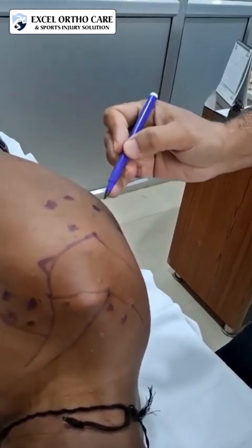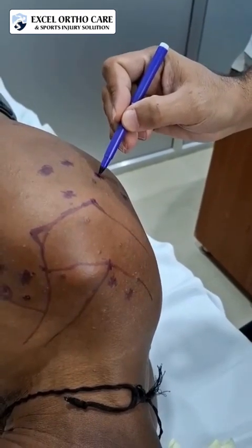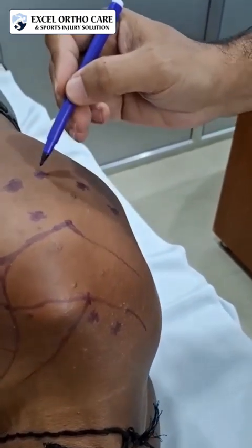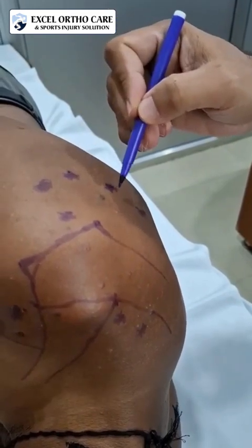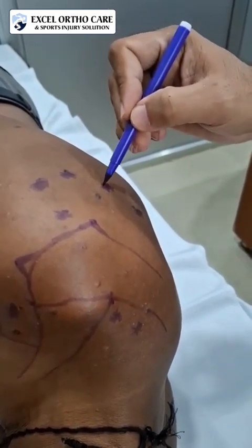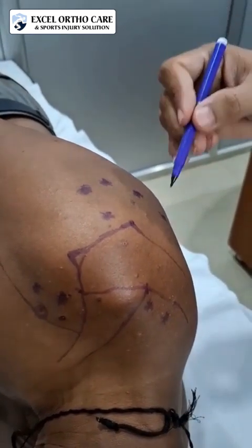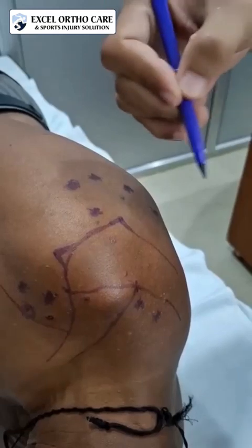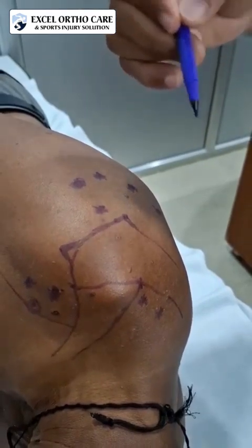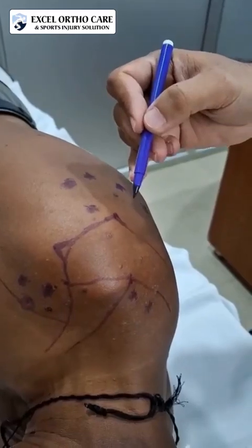The next important portal is the inferior posterolateral portal or the low posterolateral portal. This portal is midway between the posterior portal and the posterolateral portal. This inferior posterolateral portal is used in intra-articular loose body removal, for the anchor placement in posterior glenoid, for the suture passing from the labrum, and the posterior capsular release in case of adhesive capsulitis.